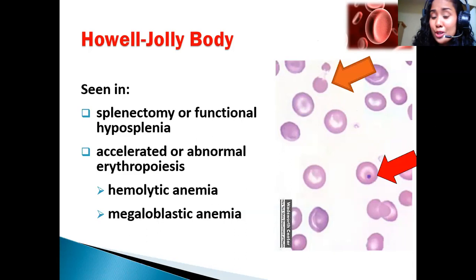Apparently, your spleen culled, C-U-L-L-E-D, culled. So tinanggal niya, past tense. In the process of culling, tinanggal niya class yung Howell-Jolly body. So yung splenic macrophage, kinagatan niya. So now we have a bite cell, or degmacyte. Tama. Ang galing, no? I love it.